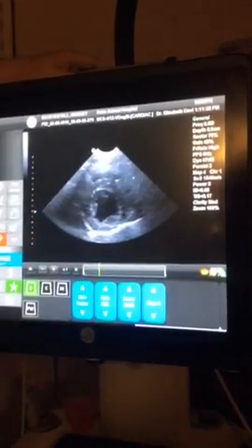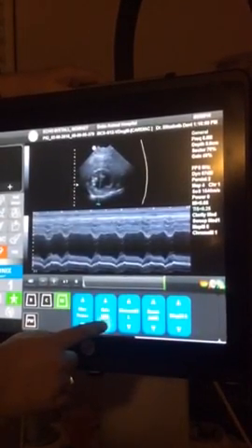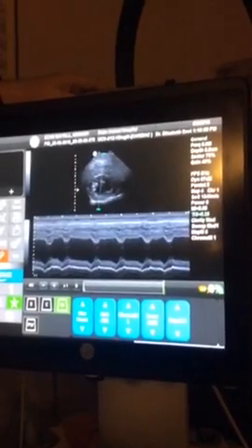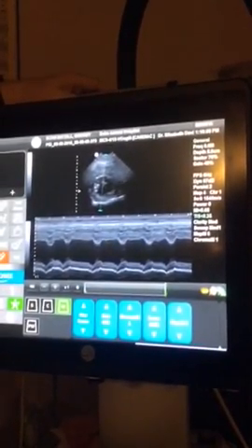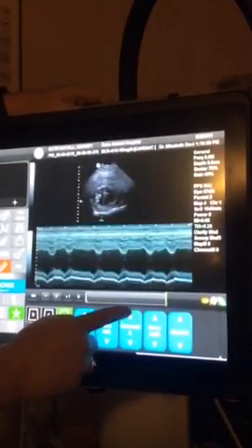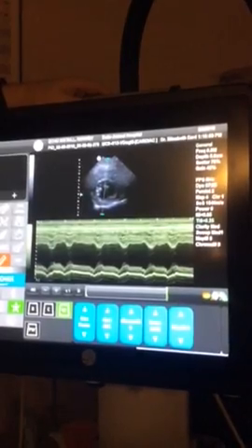We'll tap on the big screen. Okay, and again, you can decrease the gain to darken your image up a little bit so you can see your walls a little better. I've seen when I call sometimes they switch the color. You can do that as well through the Chroma M. Some people like the blues, yellows, and different tints to be able to see the walls a little bit better. That's always up to you.